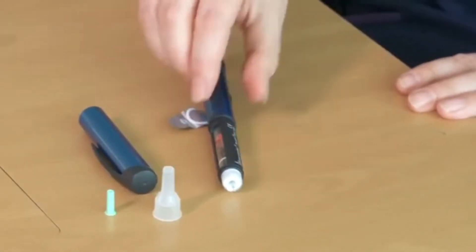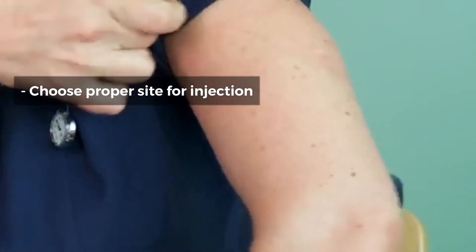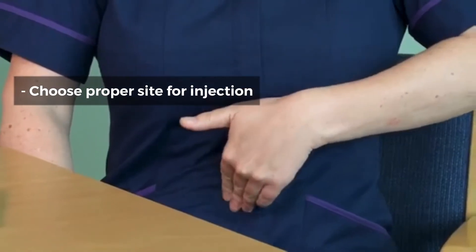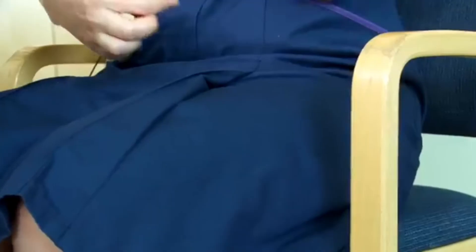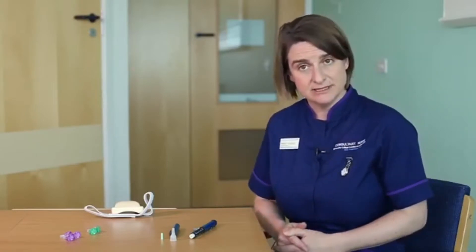Places that you can do your insulin injection include the arm — around the back of the arm — the tummy, and if you imagine your belly button, a happy smiley face around the belly button is where you can do the injection, the legs on the outer aspect of the thighs, and the buttocks.